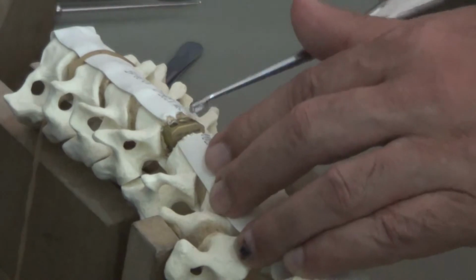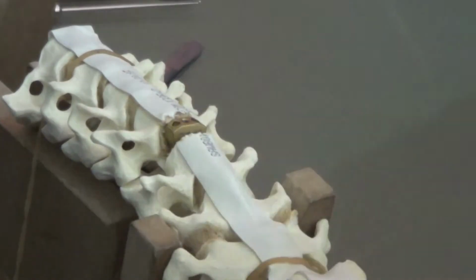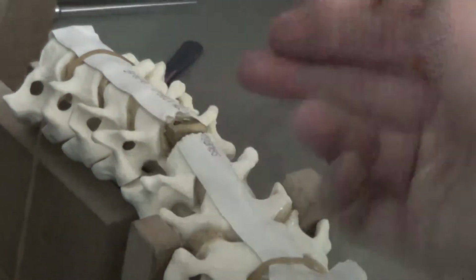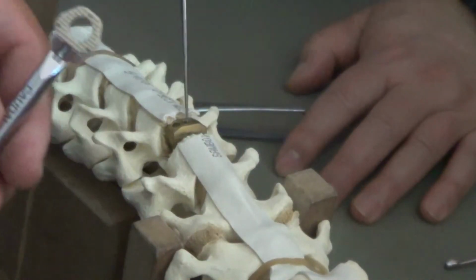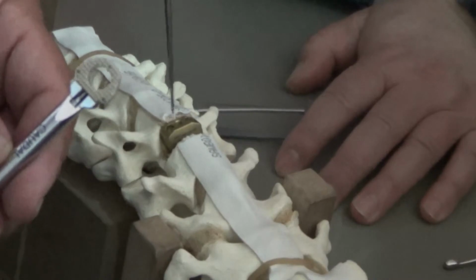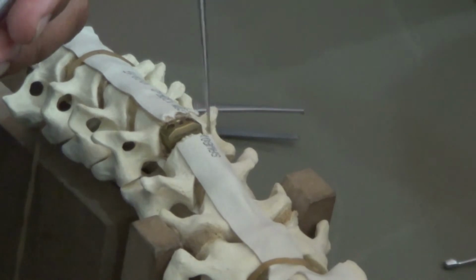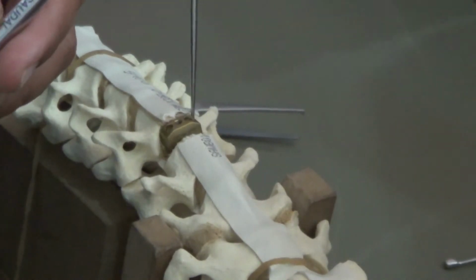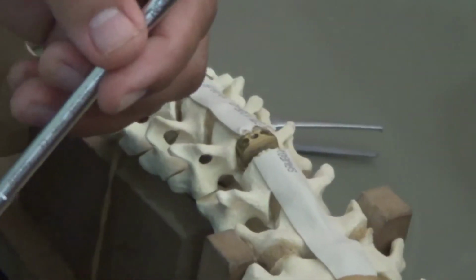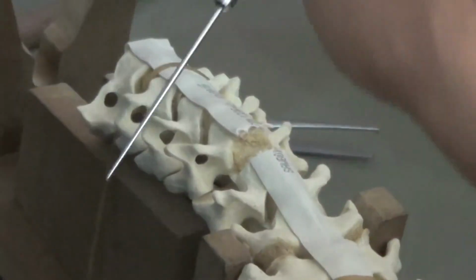Proper position. The size of that, you can measure. Very important. And remember, the disc is not always in the center. The disc is always in the posterolateral part. The midline disc has no symptoms, so we need not operate. Always we have disc herniation at the posterolateral foraminal level. So we are happy with this bone, we remove it and change to this bone. The bone graft goes inside.